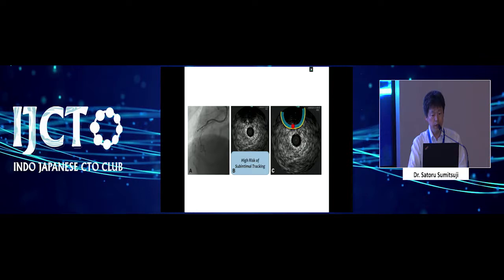And where is the wire? Oh, already maybe inside the media. That means inside the subintimal, higher possibility of subintimal tracking.